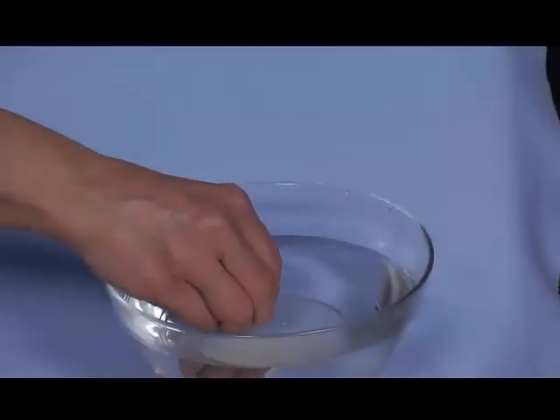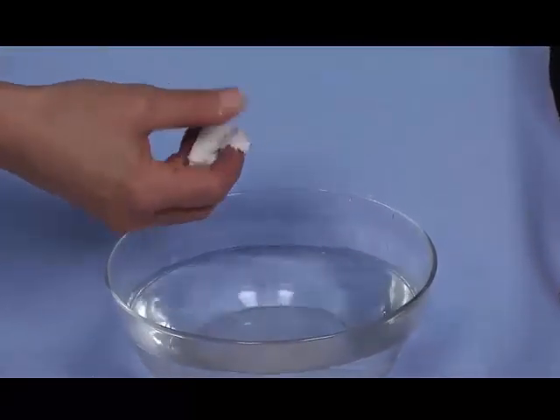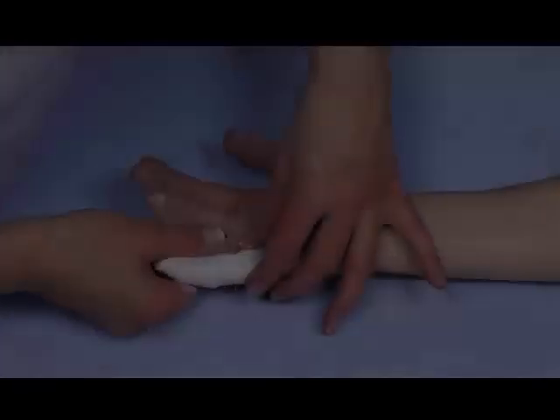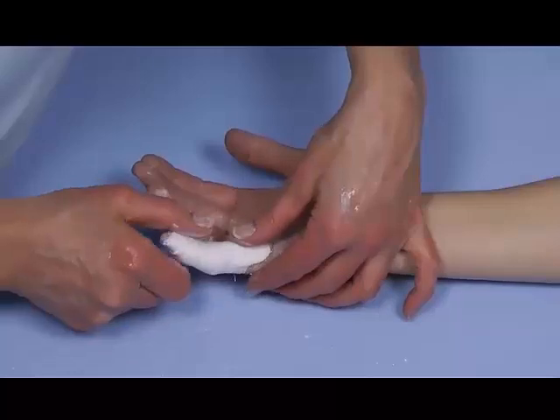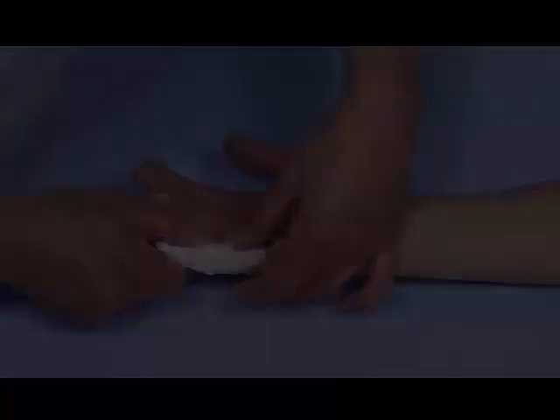I am going to immerse it into this water and then squeeze it ever so slightly. You want this to be wet because it will dry too quickly if it's not wet. Once I have gotten this wrapped on, I now can hold here and press there — because remember, underneath it's hard — and I can now position that PIP joint exactly.